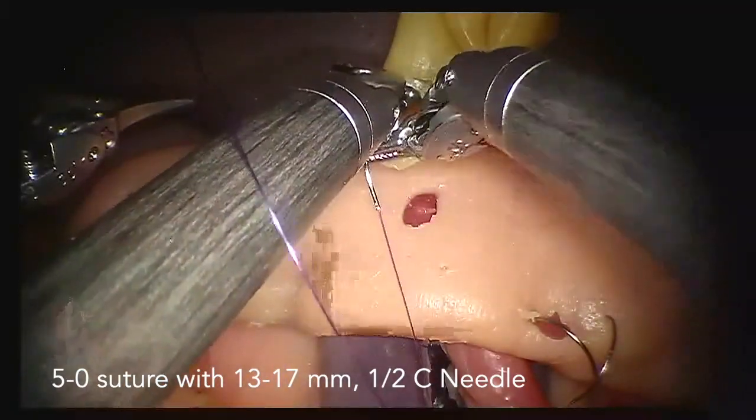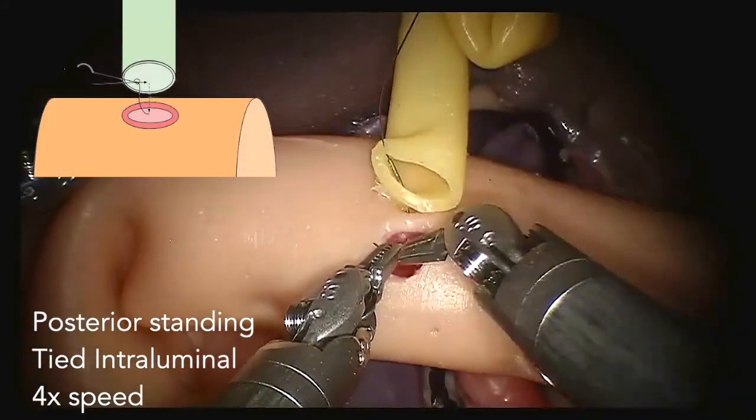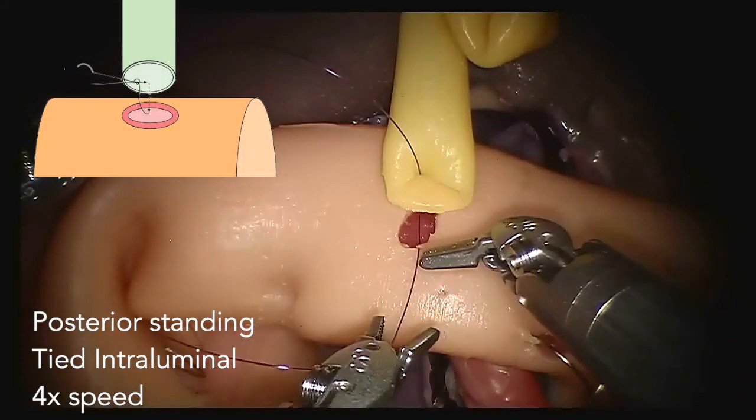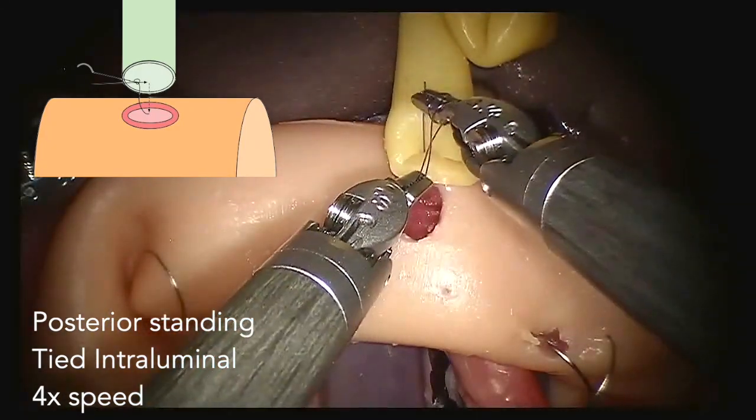For this interrupted anastomosis, we start with a standing knot at the 6 o'clock position. This knot is tied intraluminally to optimize the exposure in the duct.